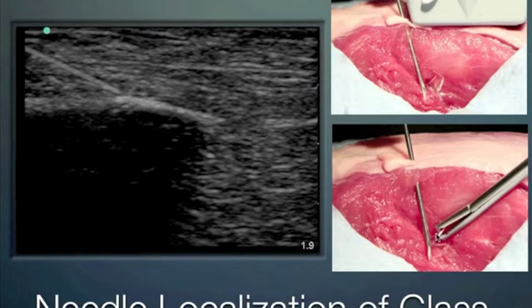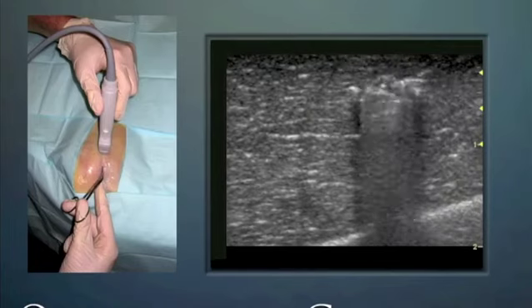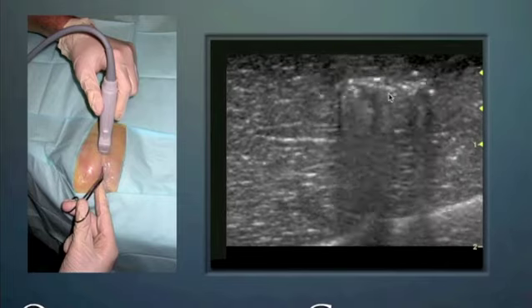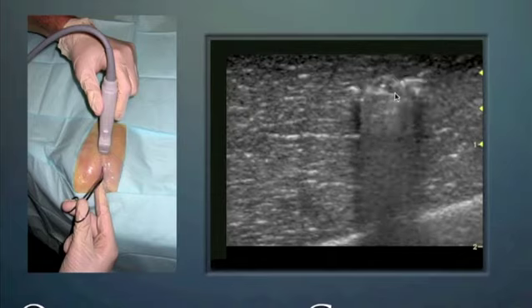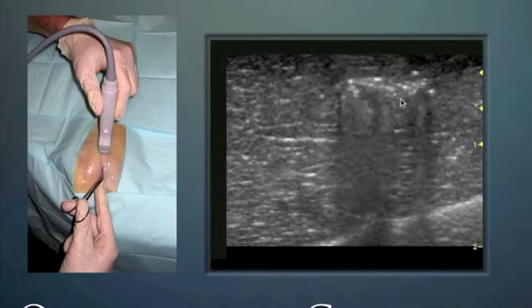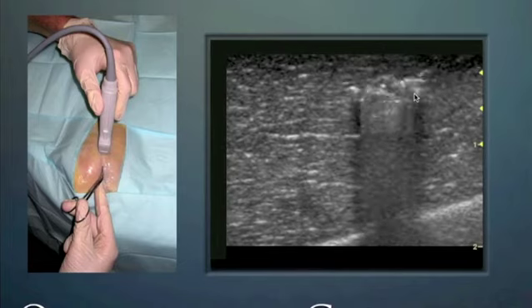And when you're opening and closing a grasping device, this is how it can look underneath the skin on ultrasound. We see these white dots that we see everywhere. That's the air that's in the track that the grasper basically created. So as the grasper goes through the soft tissue, it creates a little air track, and that's what all these little white dots are here.